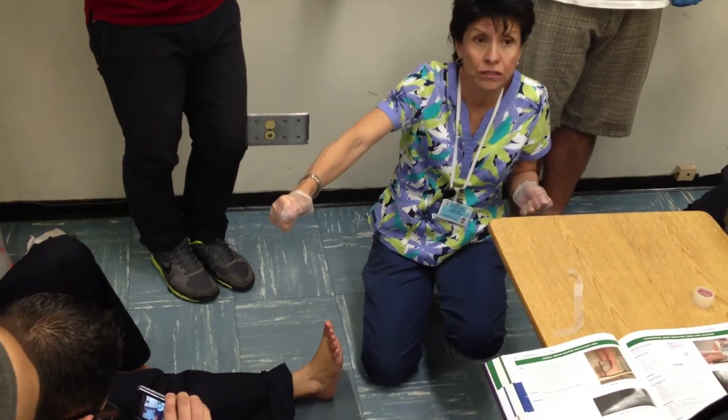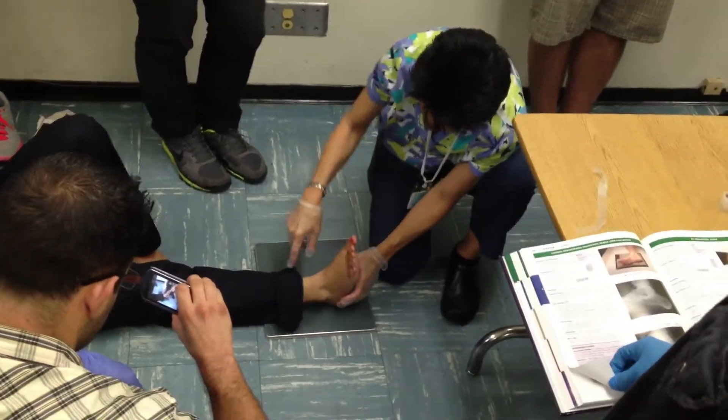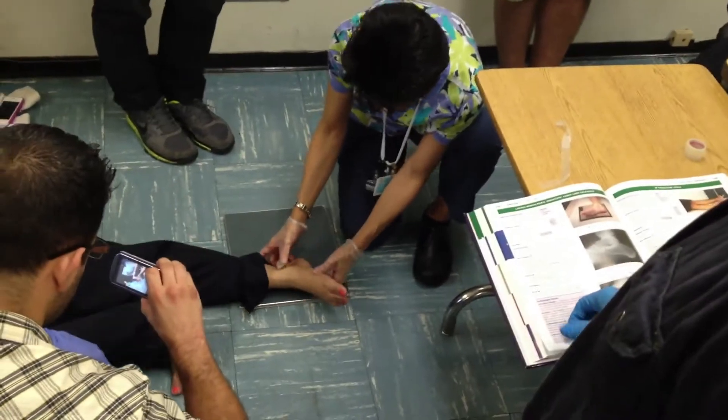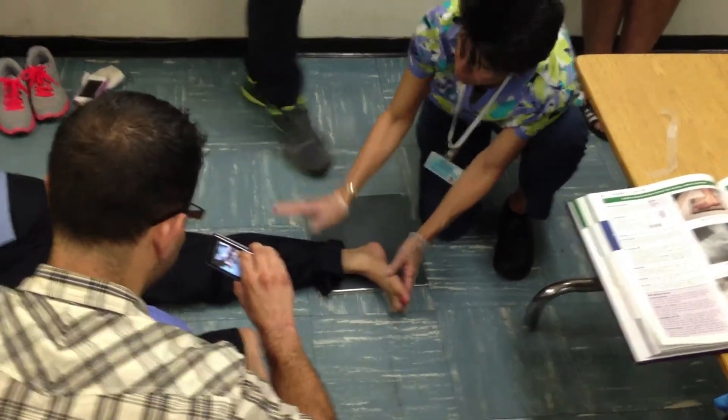That heel better be stretched. Lift up. Turn over on your side — you're going to do another lateral foot.